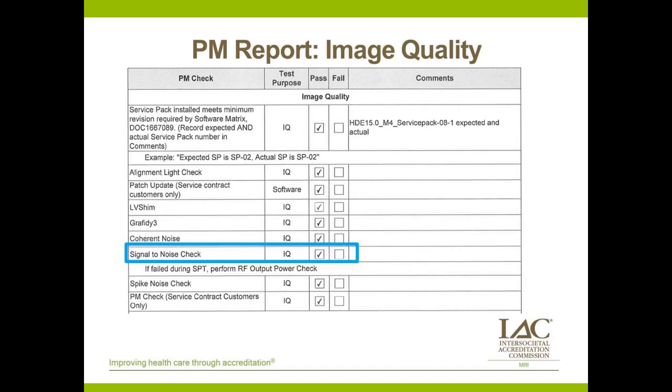And I say, well, that's great that it's so much better than the spec, but it makes me wonder whether the spec is appropriate. So something else to keep in mind when you're looking at these numbers, you don't want to see huge differences because at that point, something that has a normal signal noise ratio of over 400, by the time it drops below 35, there's going to be a lot more wrong with the system in order for something like that to happen.